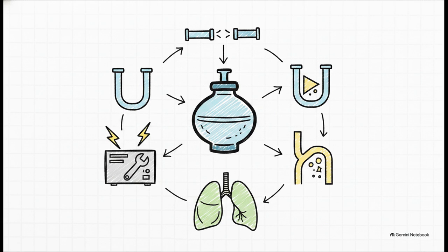And hey, never ever forget your ultimate failsafe. If you cannot figure out what the machine is doing and your patient is desaturating, literally disconnect them from the vent and bag them manually. You instantly remove the complicated equipment from the equation and you secure their airway yourself.